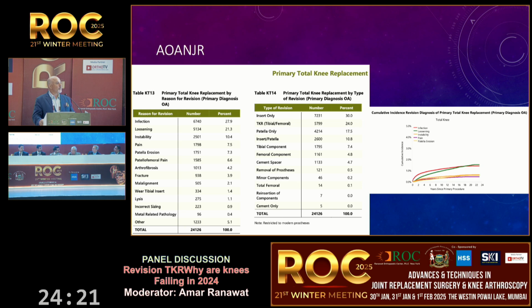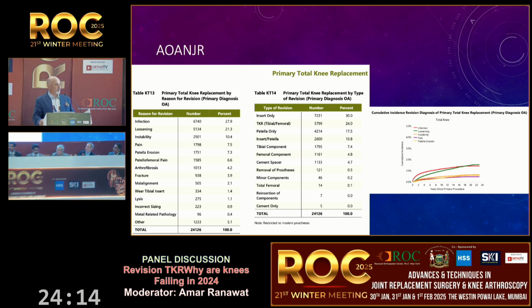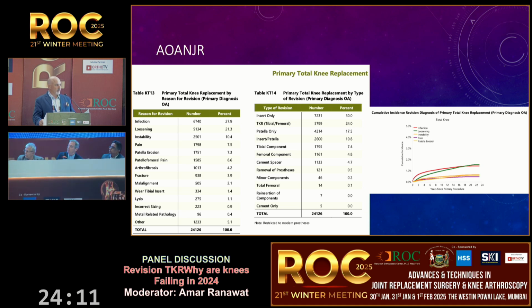Give me another one. Cement onto a clean back of an implant, making sure that there's no fat in the interface between the implant and the cement. So both sides, implant and bone side. Pulsavac, open the micro holes and put the cement on both the implant and the bone. Anybody put their finger in the keel and pressurize there? Yeah. Okay. So I think we can spend all day talking about alignment, but we need to also talk about cement technique.